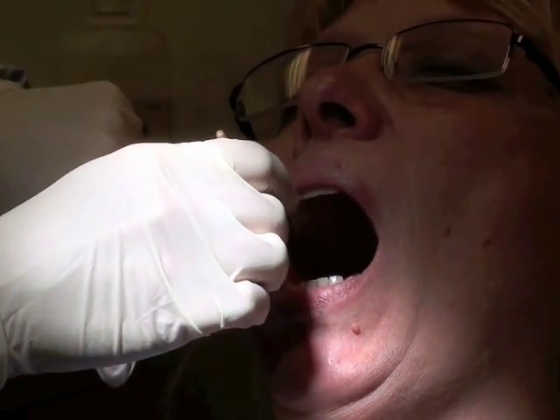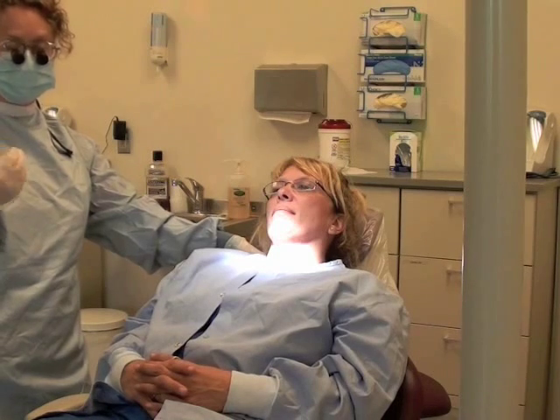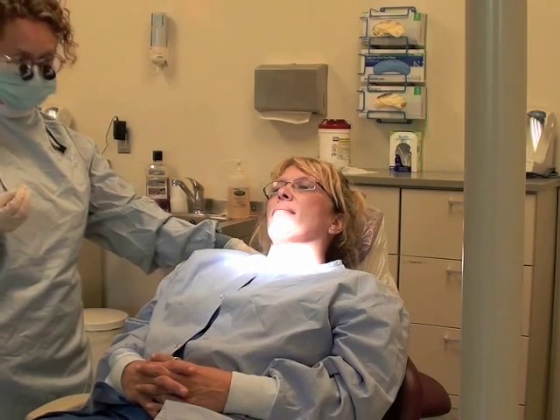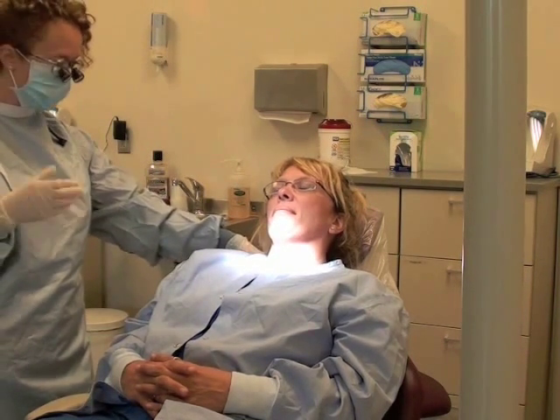After you've applied it to these surfaces, have the patient close their mouth to allow the fluoride varnish to set. It is important not to allow your patient to use the saliva ejector because the resin inside of the fluoride varnish will clog and ruin your evacuator. So if they have excess saliva, have them spit it out into a cup or a paper towel.